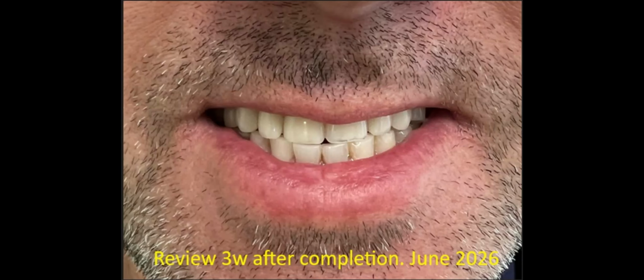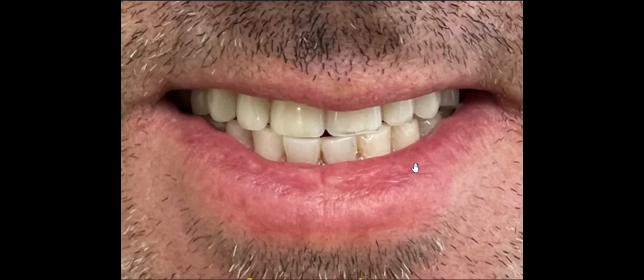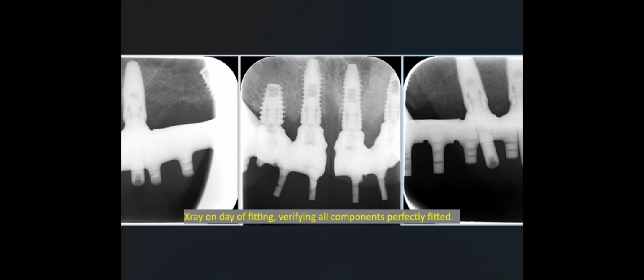Okay, so moving along. This is 3 weeks after completion of the upper prosthesis, or upper teeth, in June of this year. You can see the patient has very much fixed teeth, unlike the removable and mobile dentures that he had with his prior situation. And here are the x-rays of the work that we've done.